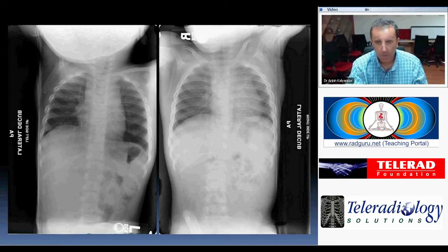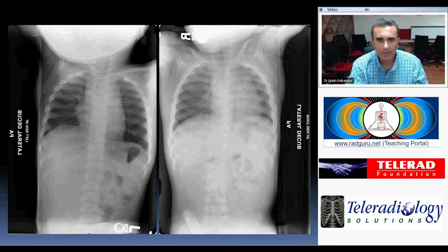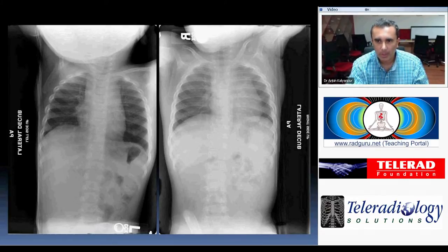If the object is opaque — as in a coin or something metallic — then it's easy to see. You do the radiograph and the object is immediately visible and we know where it is. But what do we do when it's a non-radiopaque foreign body? The answer is we do decubitus radiographs.